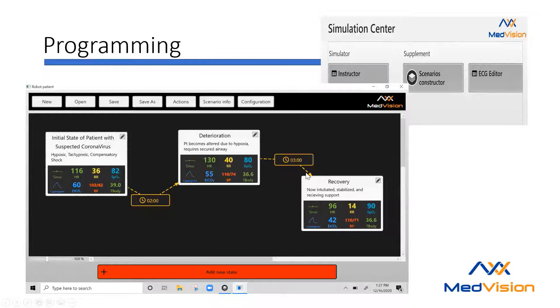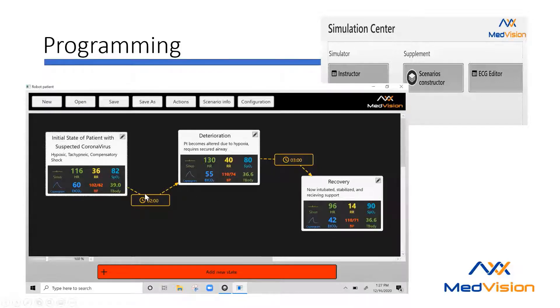At the three-minute mark it'll go to recovery. The patient's now intubated and stabilized. Our heart rate's down, he's controlled under paralytics, with a set rate on the ventilator. SATs come up to 90 — based on our patient presentation, you're not going to see SATs get a whole lot better in some of the sick patients we're seeing. The end tidal improves. We just need more time to blow off that acidosis. The end tidal CO2 waveform changes, so you can see we're having problems with inspiratory and expiratory pressure — it's more related to a new pneumonia-type end tidal waveform.